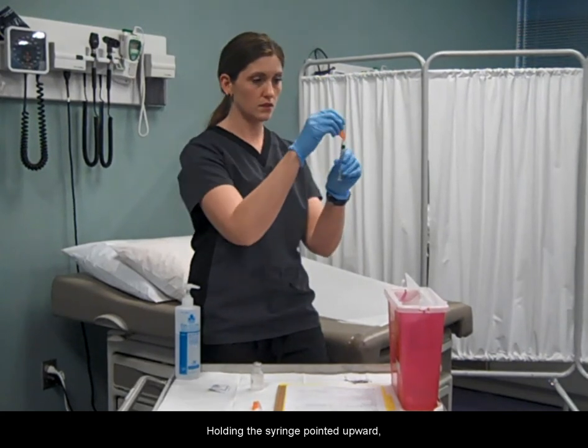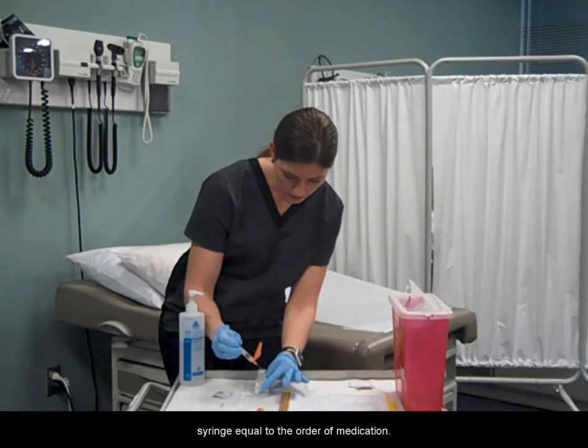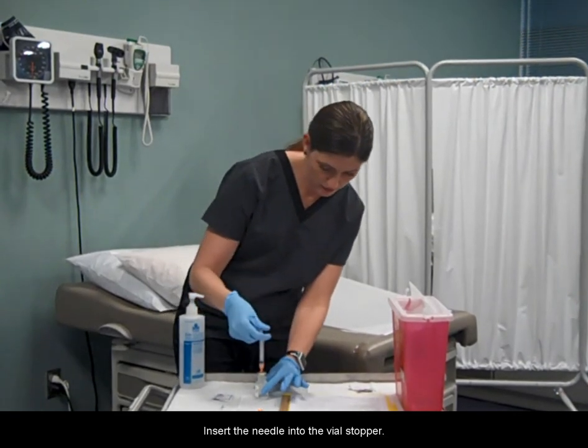Holding the syringe pointed upward, pull back on the plunger and take a volume of air into the syringe equal to the order of medication. Insert the needle into the vial stopper.